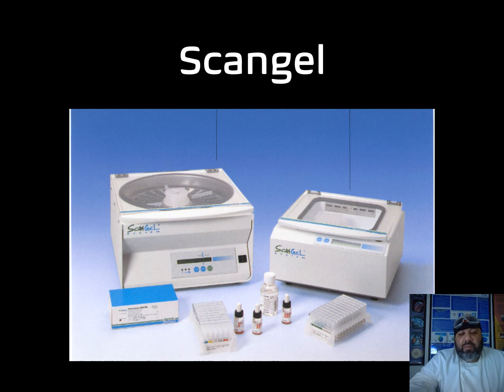In relation to the main pathology automation that has historically been used in transfusion, it has been, for example, conducting indirect or antibody screening, and there has been pathology automation or a kit out there that has been developed called ScanGel.